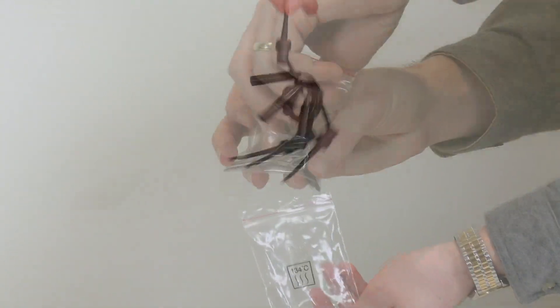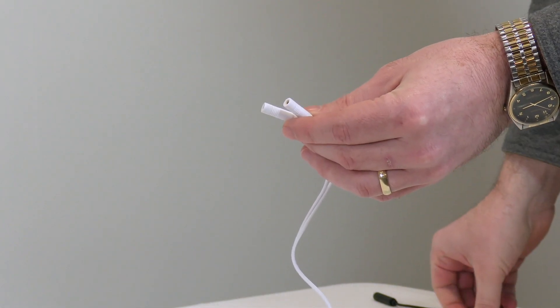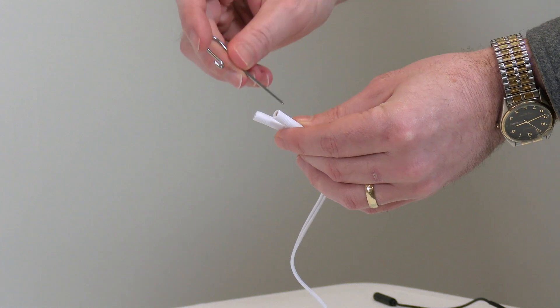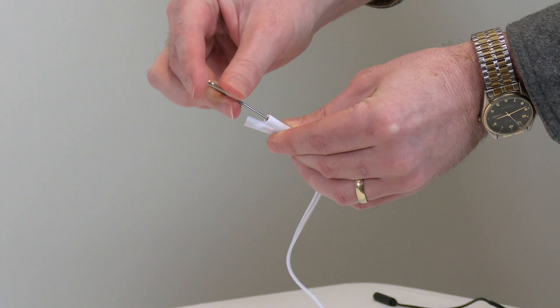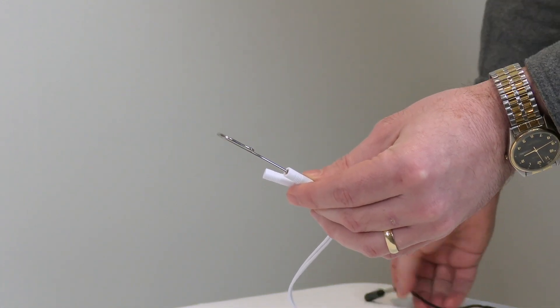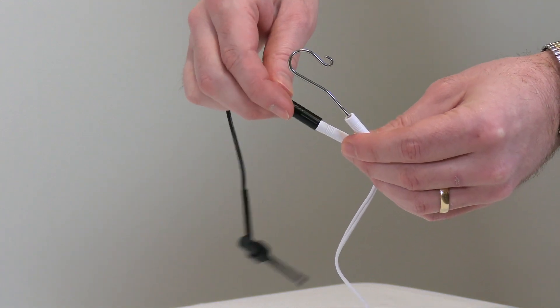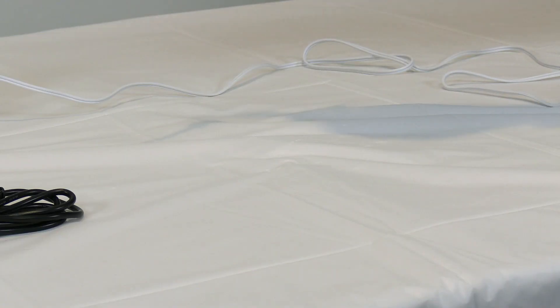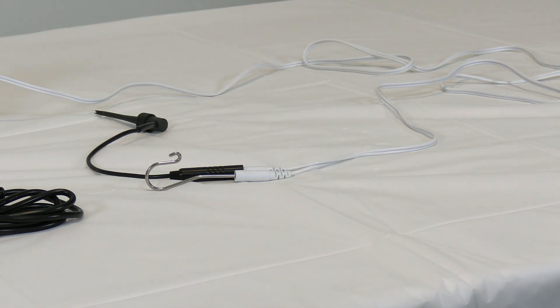Next remove a file clip and lip hook from their bags. Insert the file clip and lip hook respectively into the two sockets of the measuring wire. Please use the original components included in the Apex Locator Kit. Other brand components may not be compatible, causing inaccurate measurements.